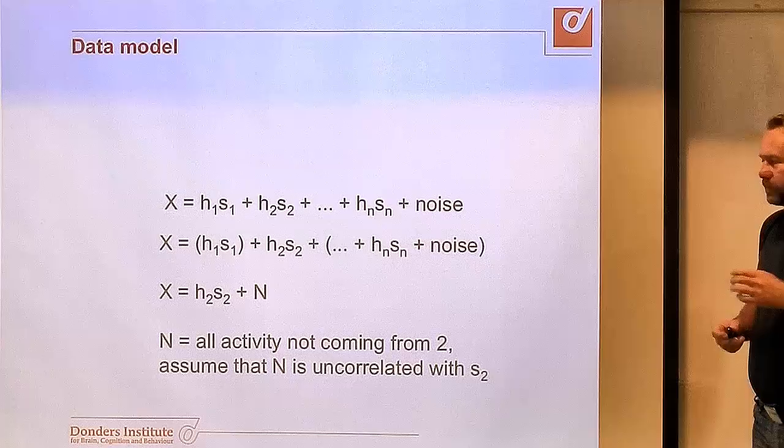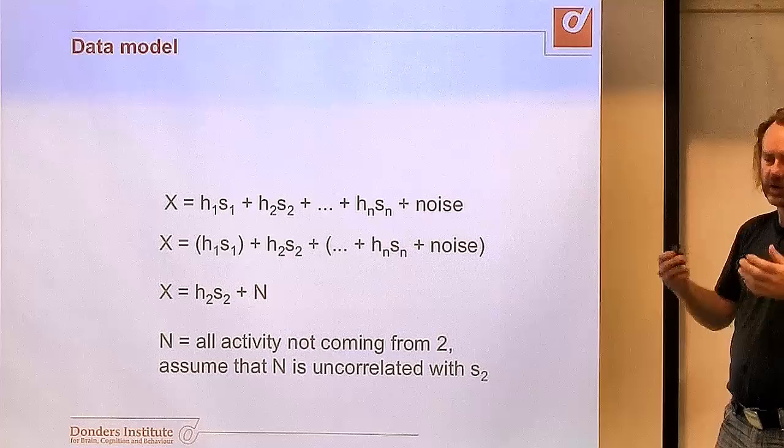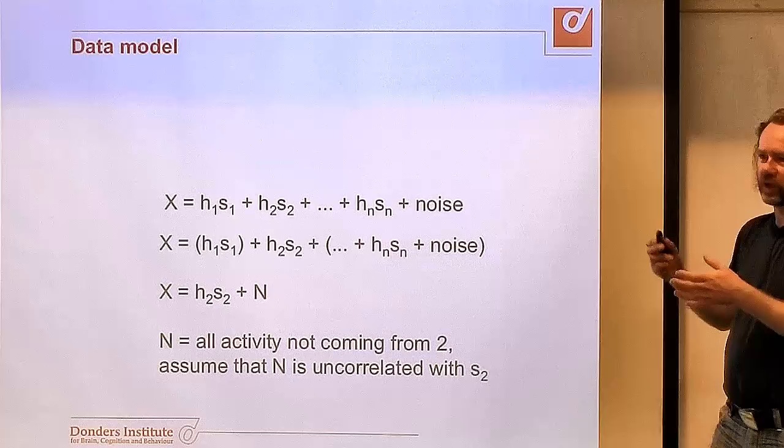And that's something that I can repeat for many different source locations. If I'm at another source location, I'm just going to call H2 times S2 the signal of interest, and the rest is the noise. Of course, it's not the noise, but it's the signal that I'm not interested in. And that's something that I repeat over and over again.